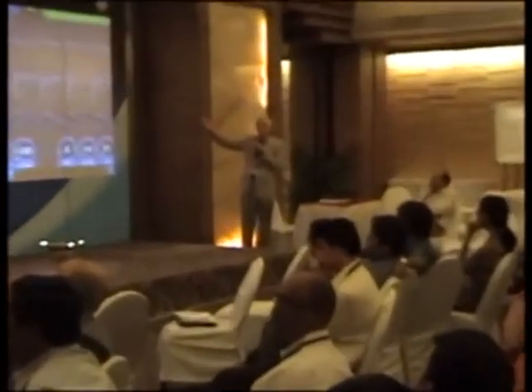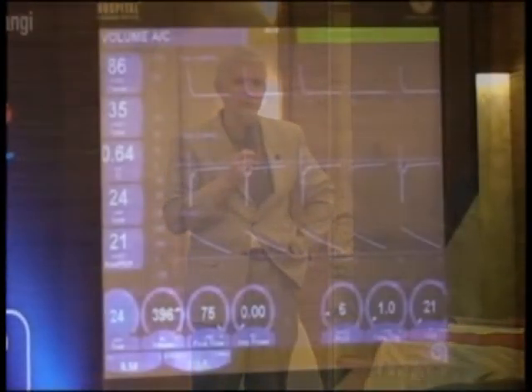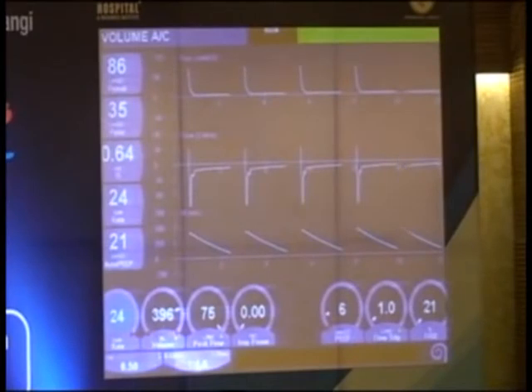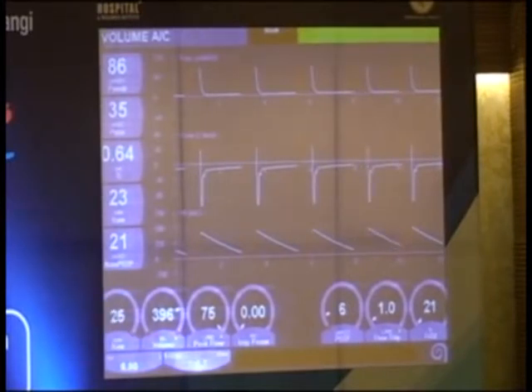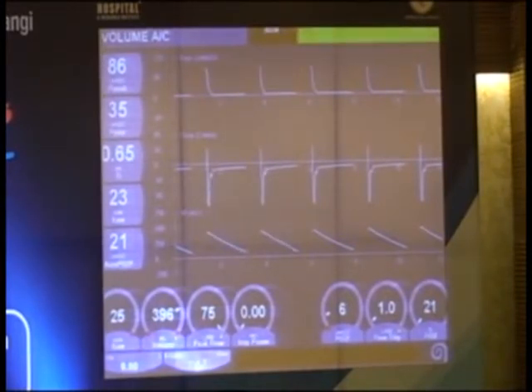And this is what we would do if this patient was still air trapping on these high ventilator settings at risk of pneumothorax. That's what we'd be worried about. If this child has a pneumothorax, there's going to be big trouble very quickly. So that's why we want to fix this air trapping. And while we are figuring out what to do next on the ventilator, it would probably be wise to get some intravenous terbutaline or salbutamol or isoproterenol going in addition to the nebulized albuterol.